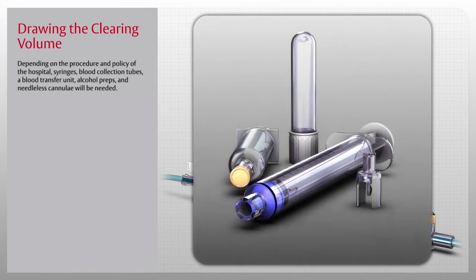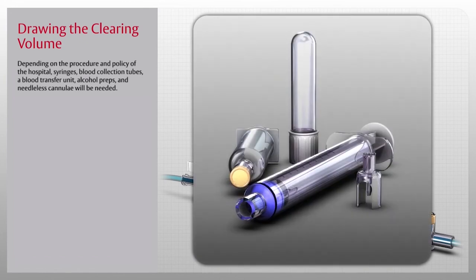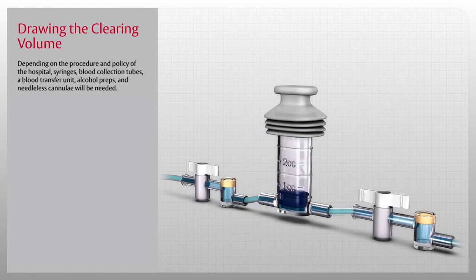Note, depending on the procedure and policy of the hospital, syringes, blood collection tubes, a blood transfer unit, alcohol preps, and needleless cannula will be needed. First, close the distal shutoff valve by turning the handle perpendicular to the tubing.